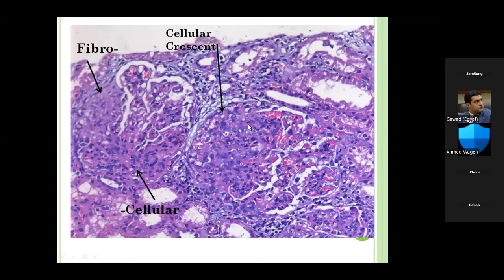And what is this? Neutrophil. We have mentioned it in the last lecture. This is a karyorrhexis. This is probably a neutrophil, and this is a destructed neutrophil that could be called karyorrhexis. This is another neutrophil, and this is another karyorrhexis, and another neutrophil. So all of this could be termed a mixture of cells.